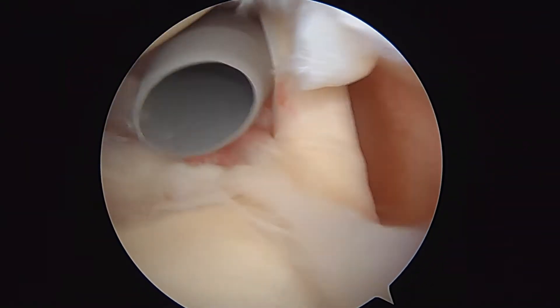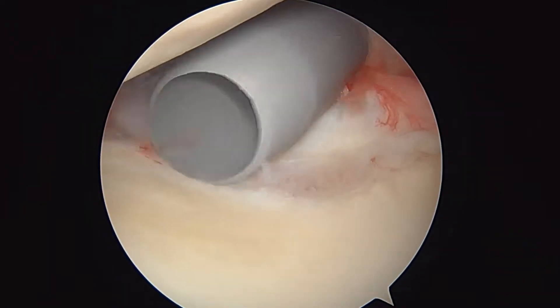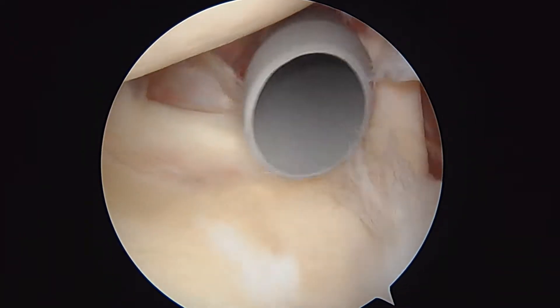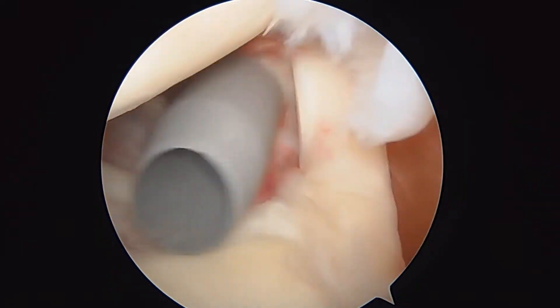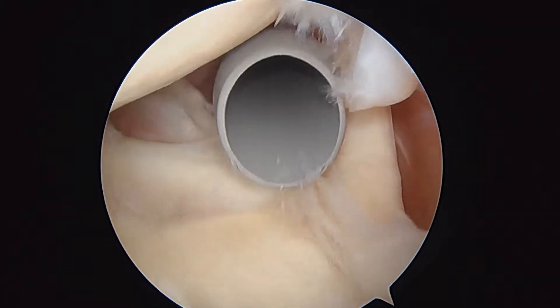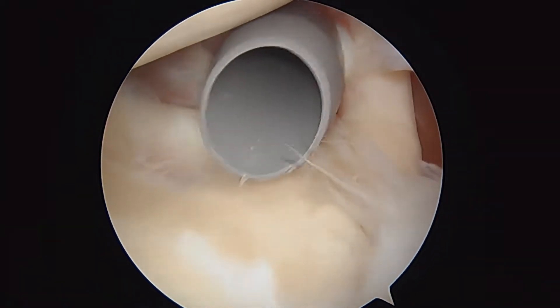Hi, it's Dr. Buford. We're just getting started on the left shoulder. We're looking in from the back to the front. Everything that you see is magnified 30 or 40 times on the screen. We've got a great cannula coming in here. The opening in that cannula is about 6 millimeters — maybe a quarter of an inch — and you can see some fraying in some of the structures here.